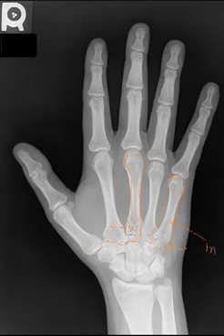The base, which is in the region of the carpo-metacarpal joint. There's also the shaft, which is the midsection or the thinner section of the metacarpal. And we have the metacarpal head, which is slightly rounded. It is normal to have these small indentations along the metacarpal heads. The metacarpal heads articulate with the proximal phalanx.